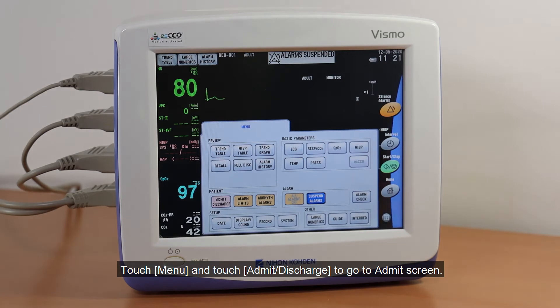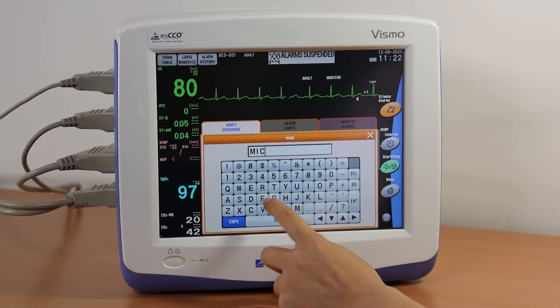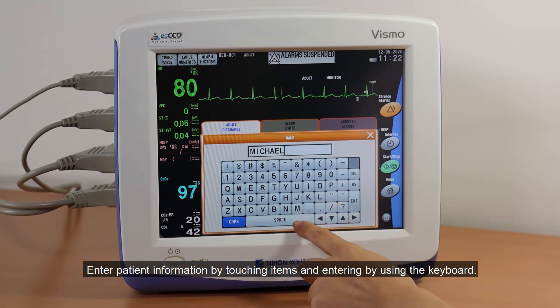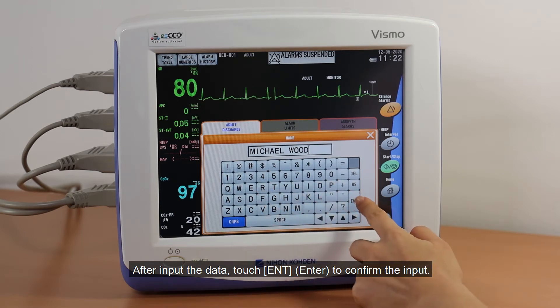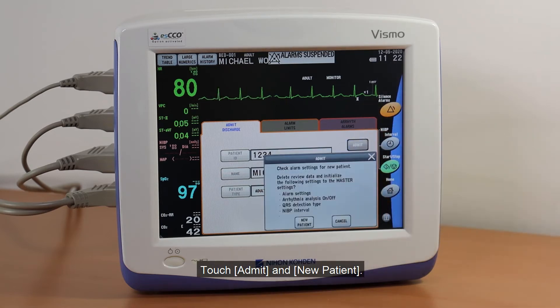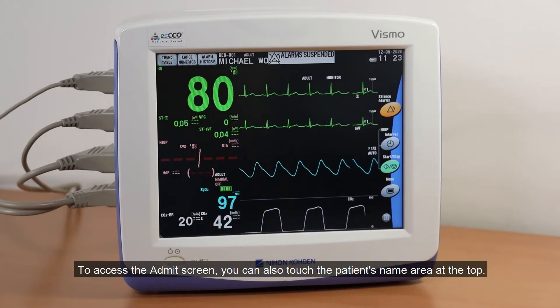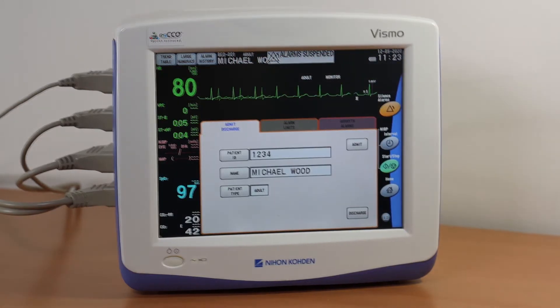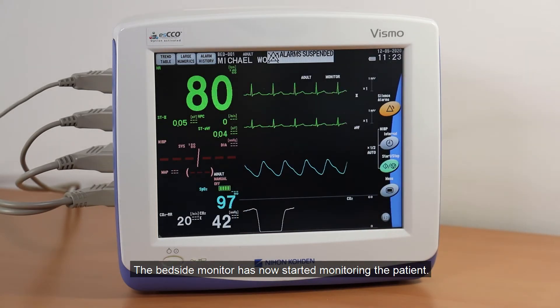Touch Menu and Admit Discharge to go to the Admit screen. Enter patient information by touching items and entering by using the keyboard. After inputting the data, touch Enter to confirm the input. Touch Admit and New Patient. To access the Admit screen, you can also touch the patient's name area at the top. Touch Home to go back to the main screen. The bedside monitor has now started monitoring the patient.